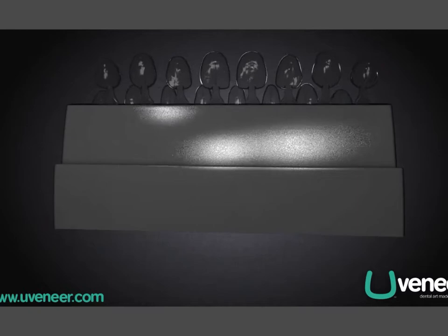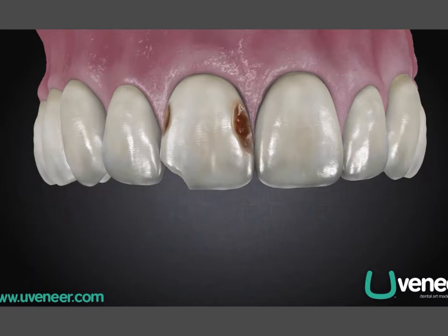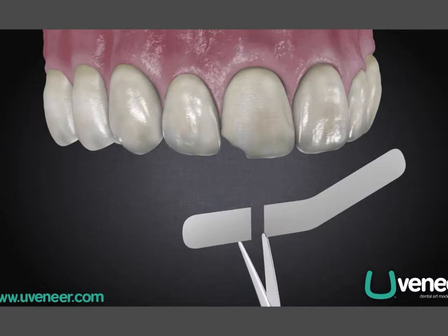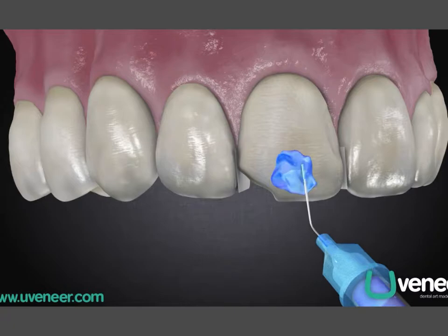So that's the kit. It has two rows of upper and lower teeth. First you grind the caries, of course, and you rough the surface of the tooth. You do one tooth at a time and insert the matrix to separate the teeth.